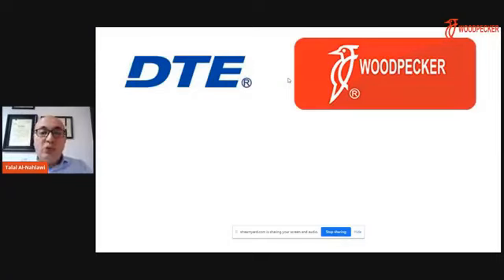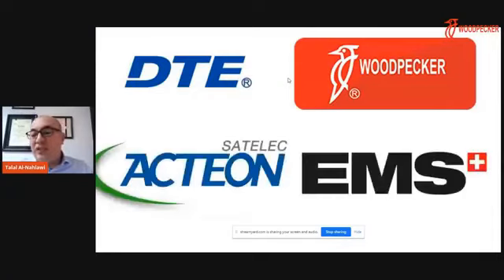And of course, you have to check the compatibility of your ultrasonic tip. If you are having the DTE ultrasonic tip, it is compatible with Acteon. And if you have the Woodpecker ultrasonic tip, it's compatible with EMS. Both versions are available from the kit according to the ultrasonics that you have, because if you apply, for example, the Woodpecker version on an Acteon or Satelec or DTE, it will not perform, it will not act properly, and you will be frustrated. You will think that the tip is not working, but actually the problem is in compatibility. So it's very important to check this.